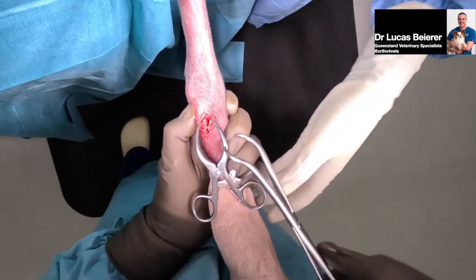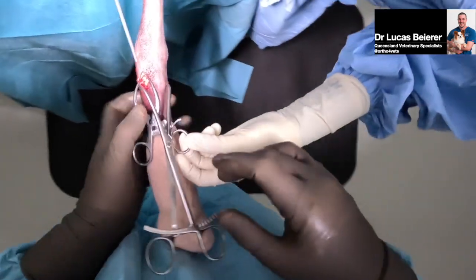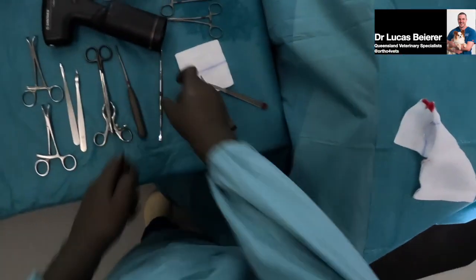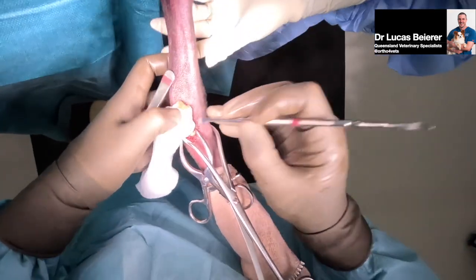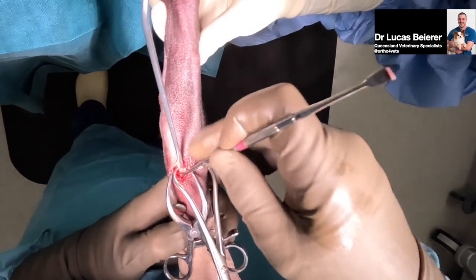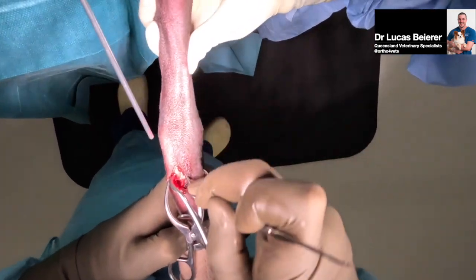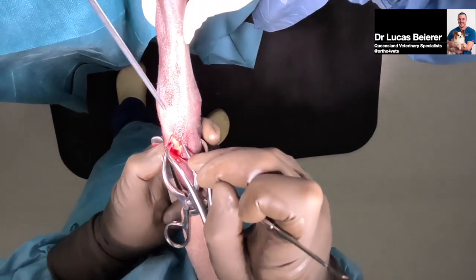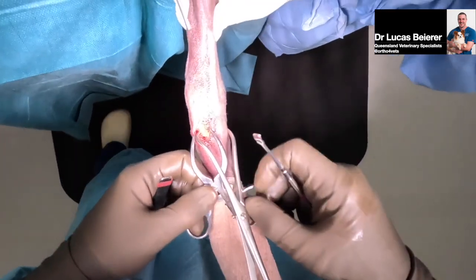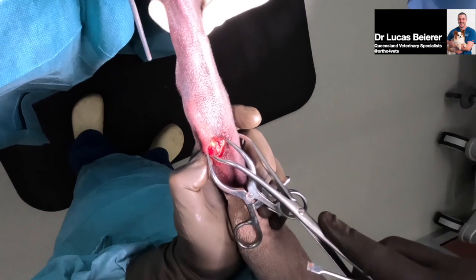Help it along with some point to points. And a bit of manual traction again. Suction. And we're just going to look at the adjacent joint surfaces to get a feel for when we've appropriately reduced the fracture. I think this part of the surgery is important because it gives you good inherent stability and also confirmation of appropriate reduction.